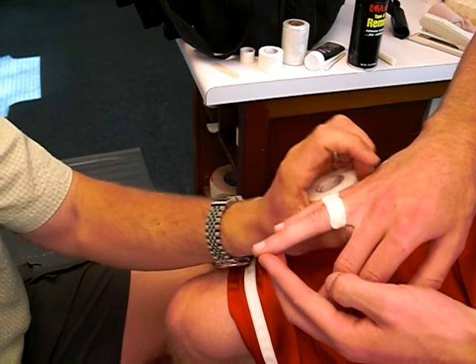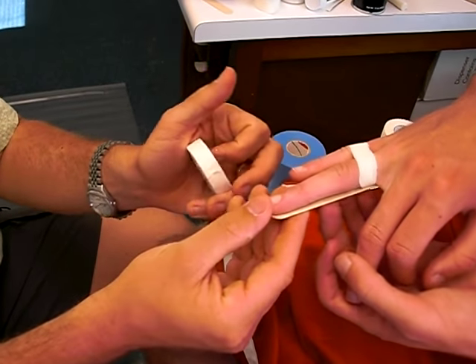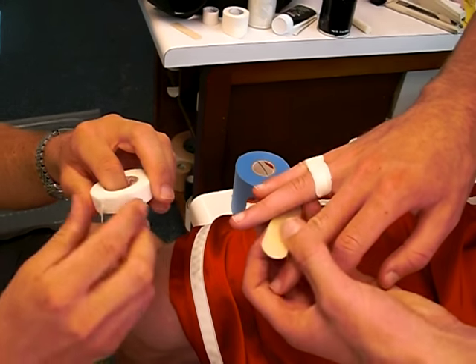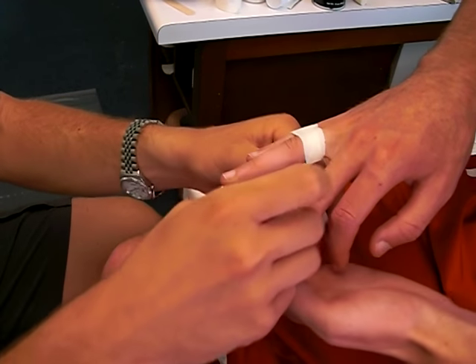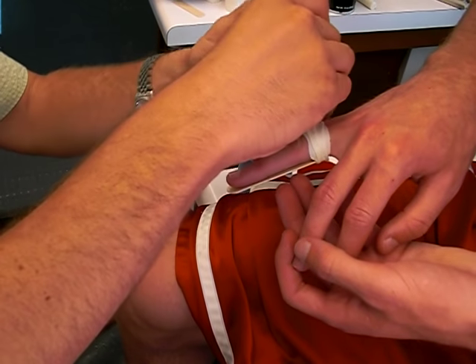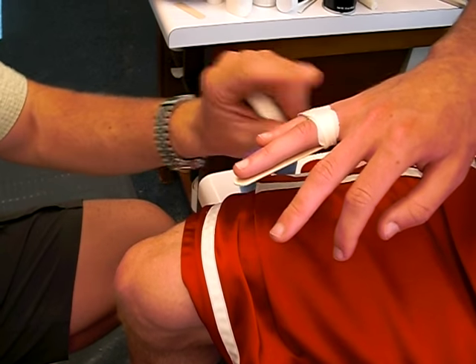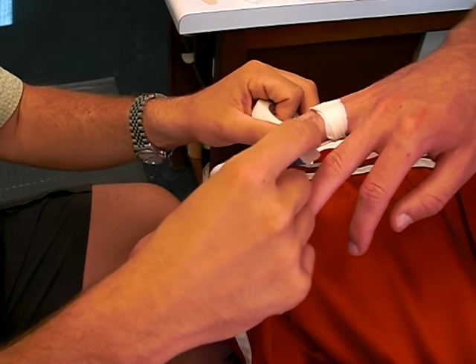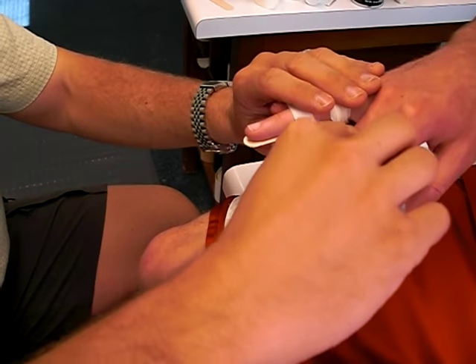Pull that around there, and now I'm going to put this here. I'm going to put that around again. The pinky is basically just giving support to the ring finger, and I'm going between the two joints — from the proximal to the DIP.